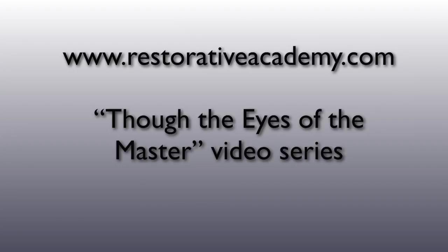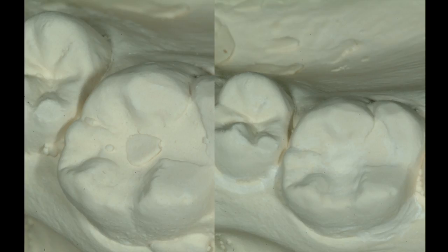It is available through the American Academy of Restorative Dentistry's website in the Through the Eyes of the Master video series. It is a revealing but discouraging exercise to look at the mounted casts in your colleagues' offices. On the left are typical bubbles that one sees on the occlusal surfaces, and on the right the cast has been groomed. Sloppy work is self-defeating.